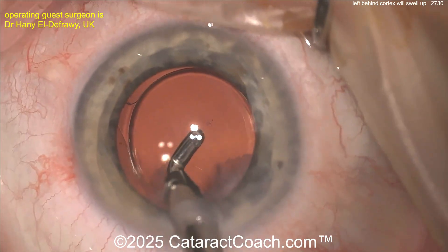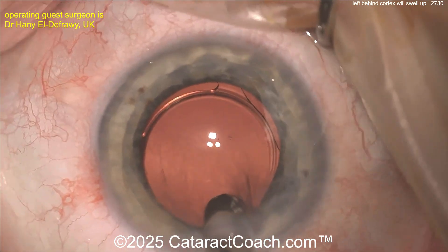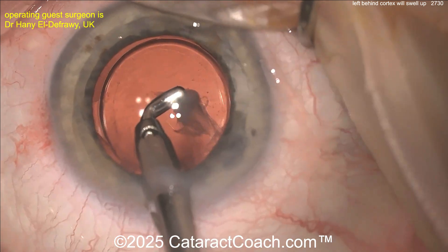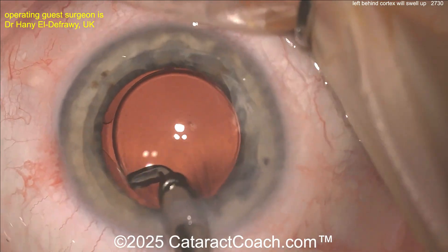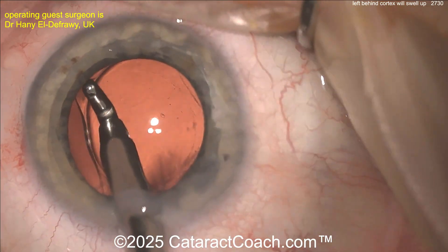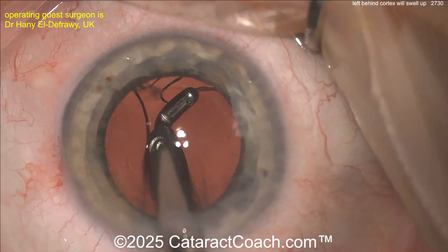Look at that — it comes out beautifully. Obviously with the IOL and the capsular bag it makes it a lot easier, because that bag is keeping the capsular bag open and keeping the posterior capsule away from your probe. Cleaning all of it out — look at that, now that looks so much better. The patient is going to be so much happier.